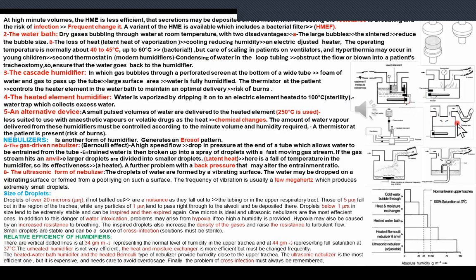Of course, sometimes this redundant tube going to the patient will accumulate fluid from the condensation. So we ought to have something to make it go back to the apparatus. Otherwise, it will be affecting the patient.